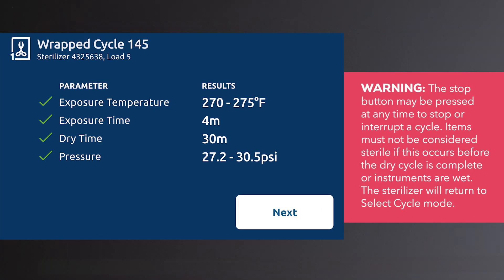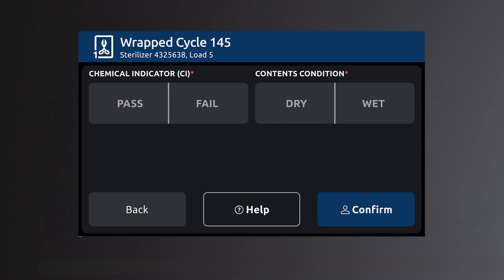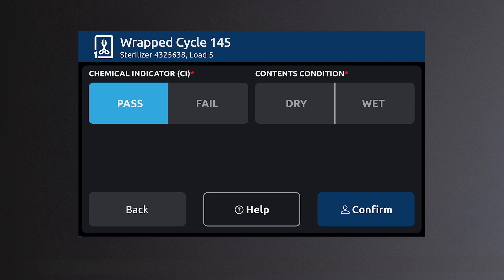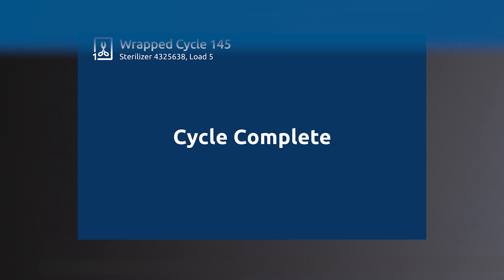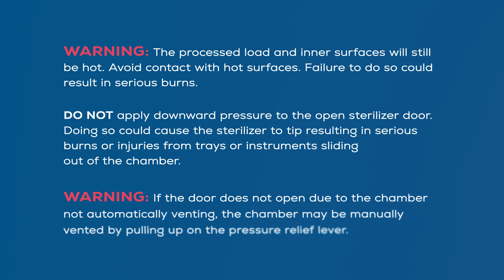Once the cycle is complete, review cycle information, then select next. Select pass or fail for the chemical indicator. Select dry or wet for the contents condition. After sterilization is complete, all items must be handled in accordance with accepted and documented standards as well as any local requirements that may apply.